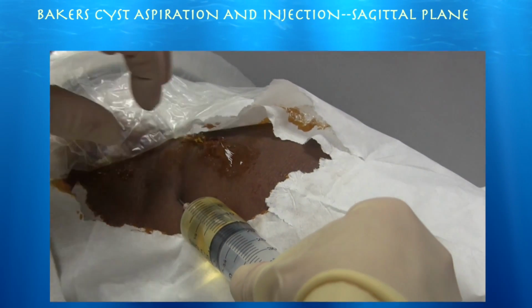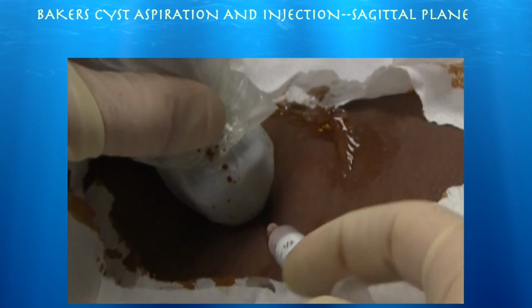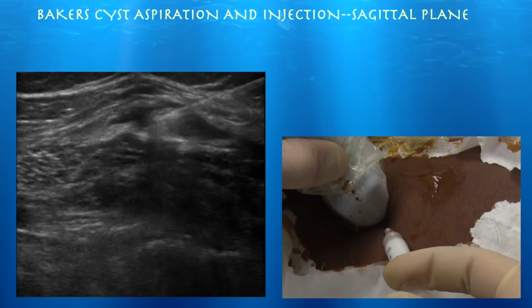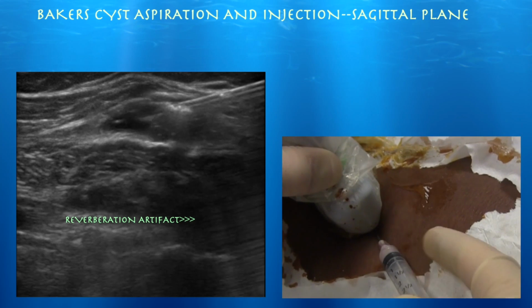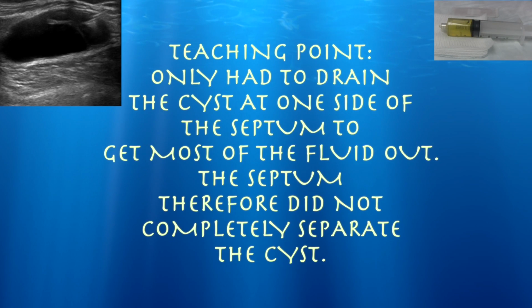I'm just going to inject it with a little bit of cortisone. Here we are, we're just injecting some cortisone. Sometimes when you break through plica or septum, it could cause more discomfort for the patient, so if you can avoid it, it's probably easier on the patient.